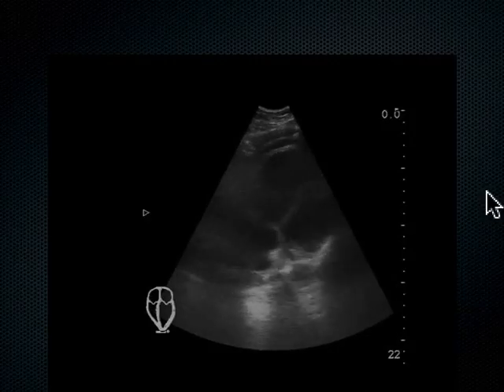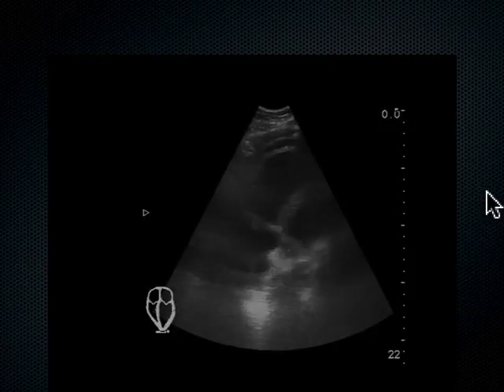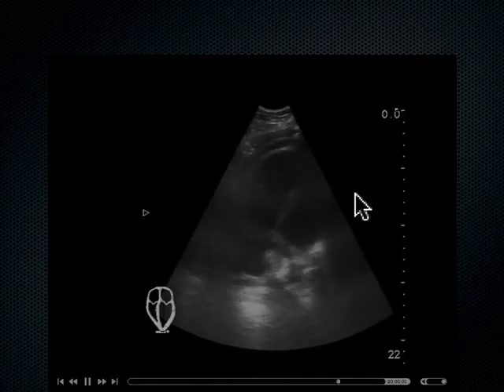It tells me the patient's still alive, okay? I don't know why they're not having a carotid pulse. It's not enough blood pressure to make a carotid pulse, but about 30% of the time, you will see organized cardiac activity like this, yet no carotid pulse. I shouldn't say good cardiac activity. This is very weak cardiac activity.